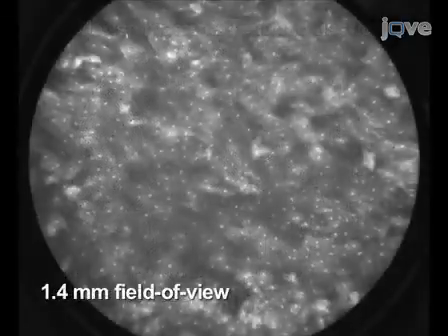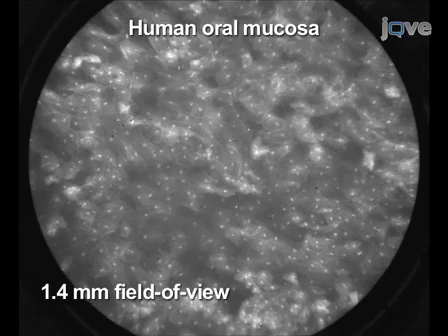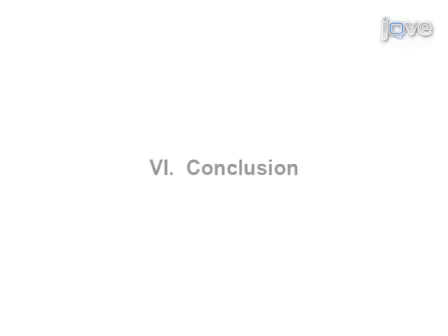In this example, imaging of the oral mucosa in a healthy human volunteer was performed using a larger fiber bundle with a 1.5 mm outer diameter. In all examples shown, proflavin was used as a nuclear labeling fluorescent contrast agent. After watching this video, you should have a good understanding of how to design and assemble a fiber optic microendoscope for in situ fluorescence imaging of cells and tissues.